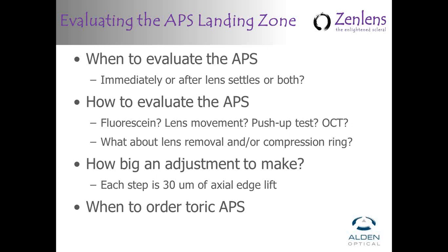We always build in enough vault that we allow for the settling over time, so that we don't have to worry about a lens touching the cornea at follow-up. But the follow-up is, like you say, almost more geared towards evaluating the peripheral curves after wearing time. So I don't have a lot of time to wait.